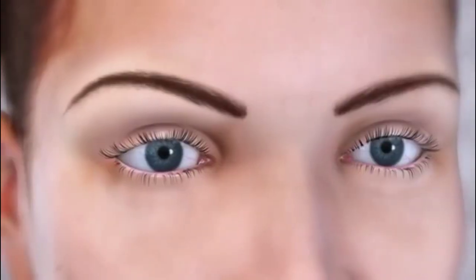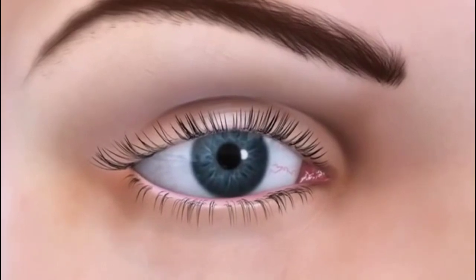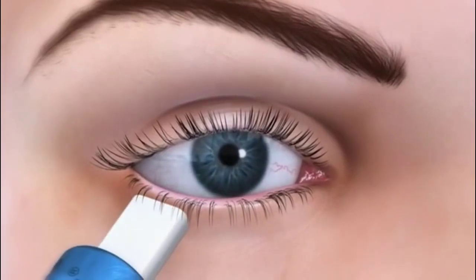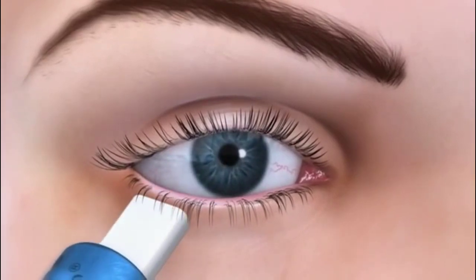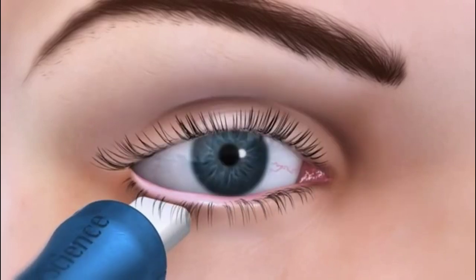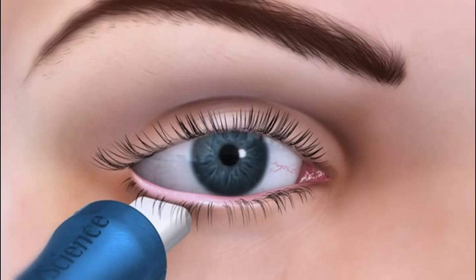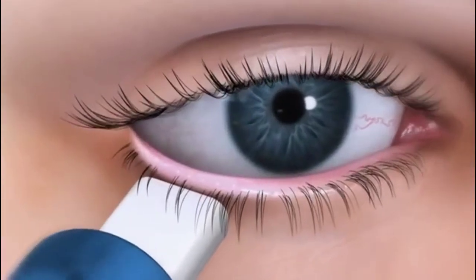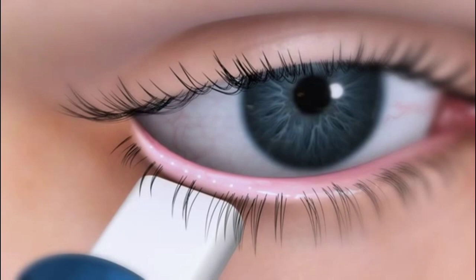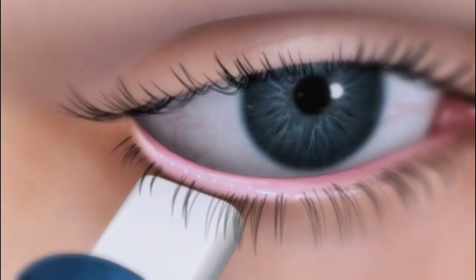Doctors now have the ability to assess meibomian gland dysfunction with a meibomian gland evaluator, or MGE. The MGE exerts pressure consistent with a deliberate blink, allowing evaluation of gland secretions in three regions of the eyelid. Using the MGE, secretions for five glands in each region are scored on a scale of zero to three.